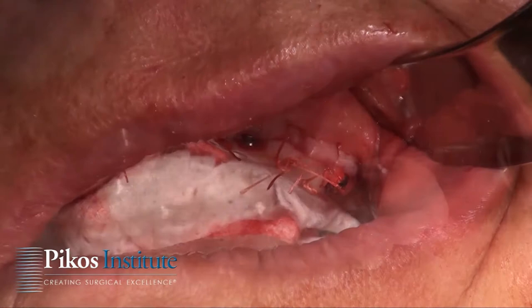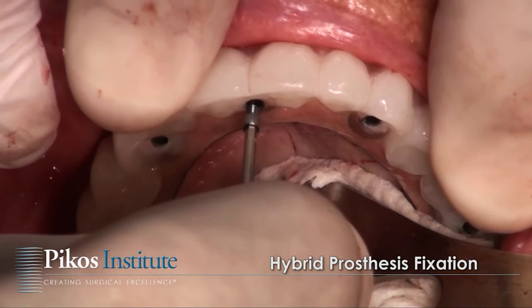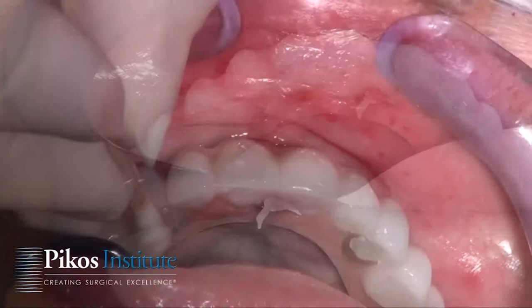Healing abutments are now removed and the prosthesis is placed into position and secured. Once that is accomplished, we verify the occlusion once again. Typically it takes just minutes to equilibrate, even in a two-arch case.